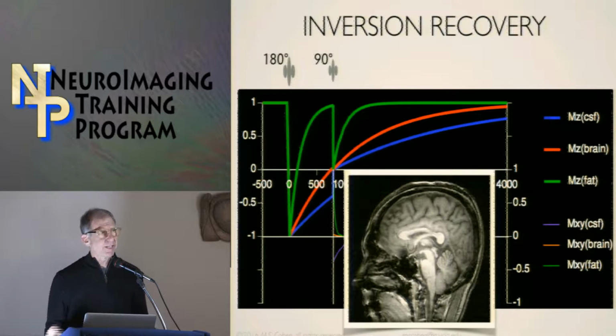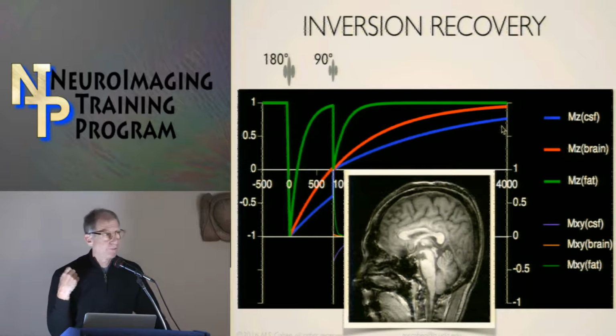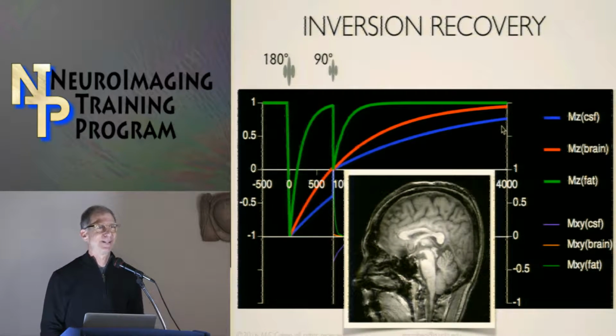And there's a lot of subtlety in setting these up because, in fact, the time it takes to go from your disturbed position after the 180-degree pulse back to equilibrium is also made longer by the fact that you're inverting the spins. So the TRs tend to be very long, and you end up with these very complicated trade-offs between the contrast you want to have and the imaging time, which I'm not prepared to, well, I mean, I can talk about it, but I don't have slides on it right now if somebody wants to hear in more detail how that works.